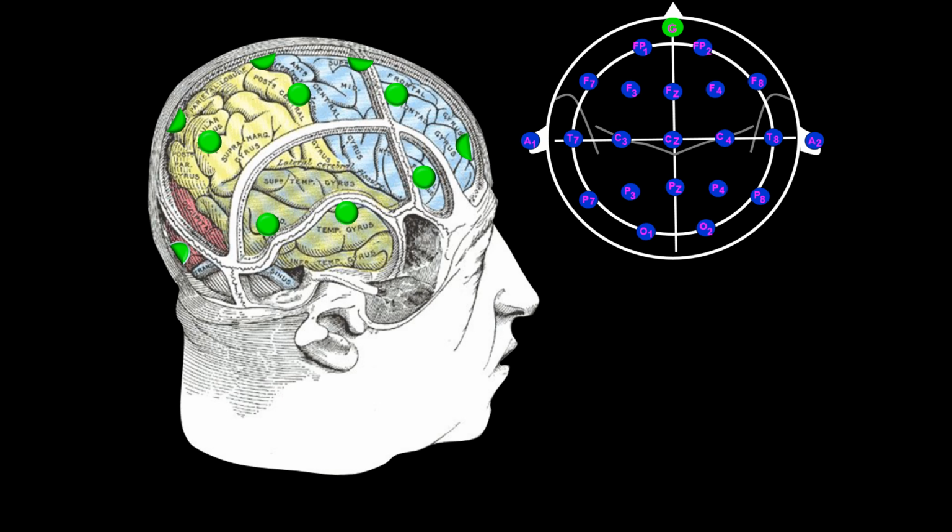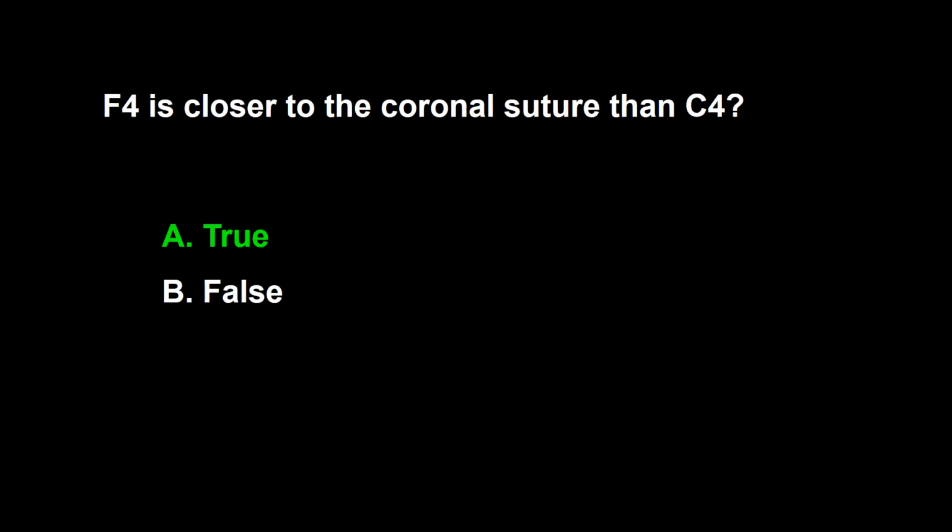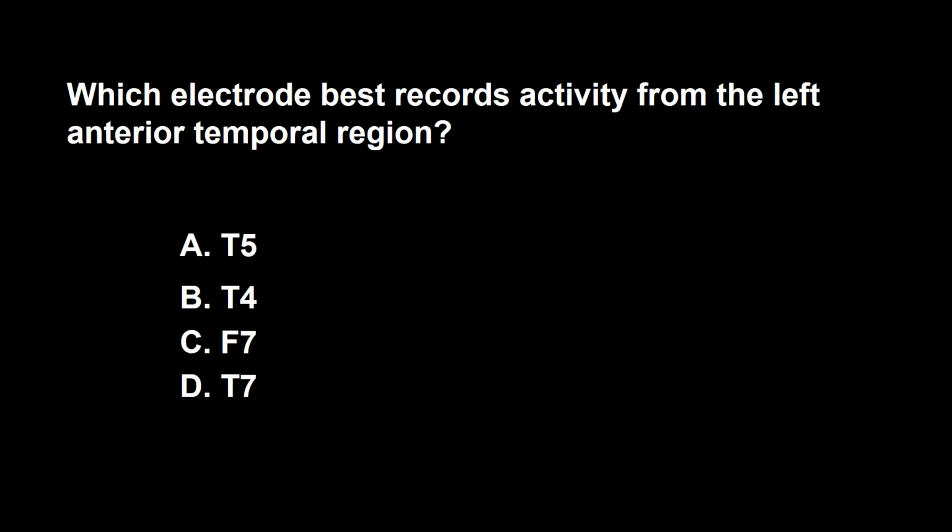In this frame, I have added the common locations of the most frequently used electrodes. I have in this frame labeled C4 and F4 electrodes. It does not take long looking at this figure to answer the question. The answer is A. Next question.